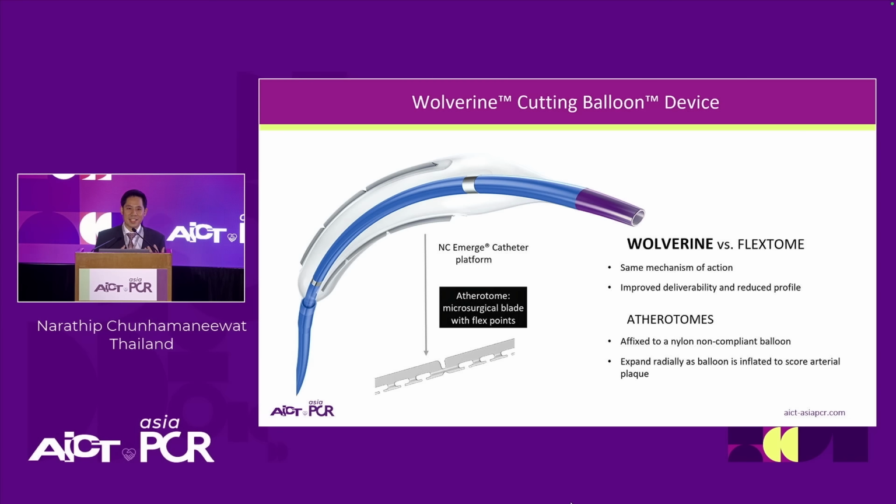A couple of weeks ago, I just did Basilica with my colleague, Dr. Natterwood, and we were trying to cut the catheter, and Dr. Natterwood asked the nurse to get better, sharper scissors. In that case, we had our surgeon on the table, and he asked, why not a surgical blade? So we changed from scissors to surgical blades, and it worked easily. So basically, when we talk about specialized balloons, there are many materials, but the cutting balloon uses surgical blades, which are very strong.